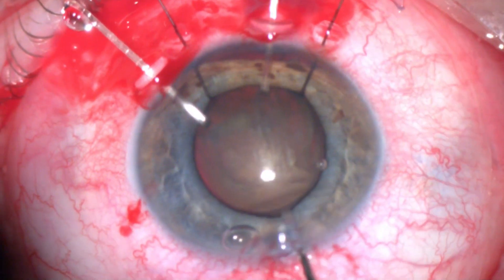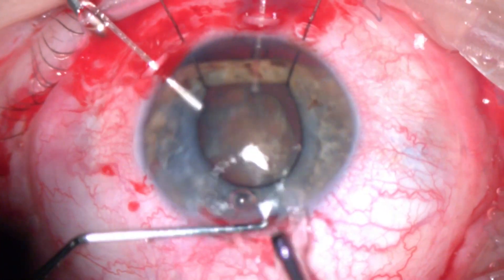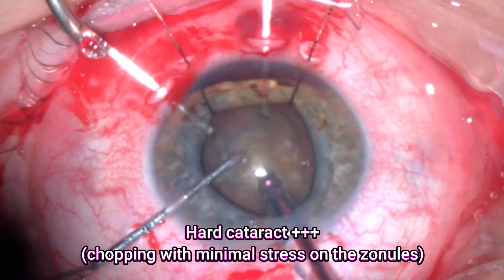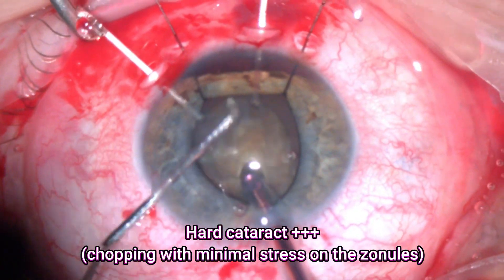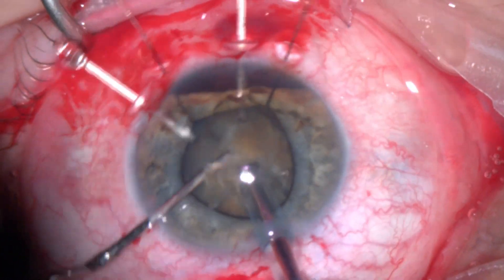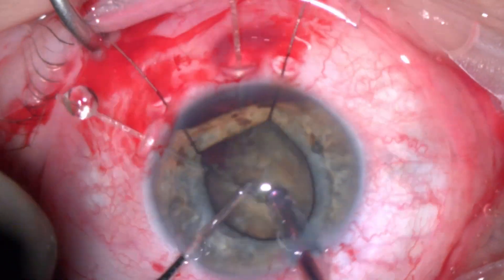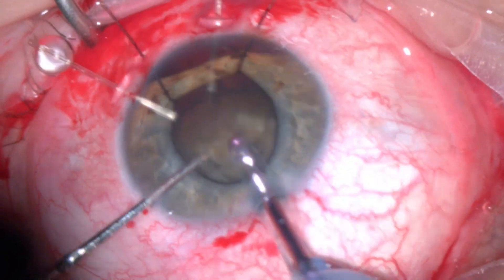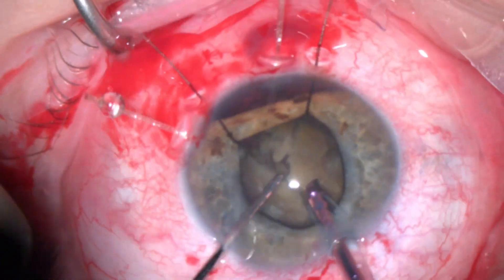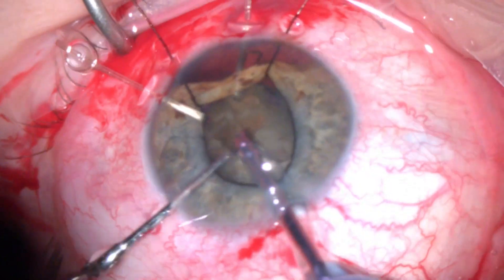Then some hydrodissection and very gentle rotation of the cataract. Now we have the capsular complex well supported. I started the phacoemulsification by direct horizontal chopping. The lens was quite hard. The main idea here is to try to chop the cataract while avoiding any stress on the zonular system of the lens.